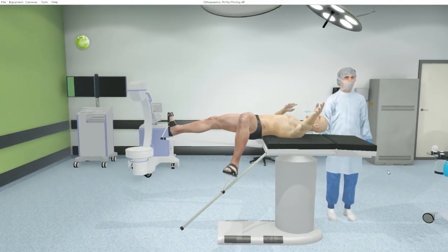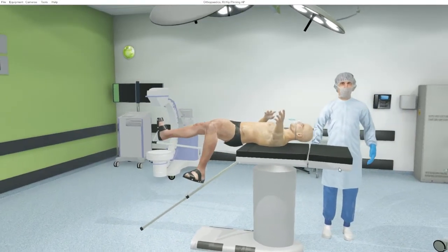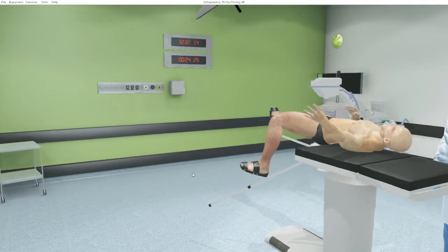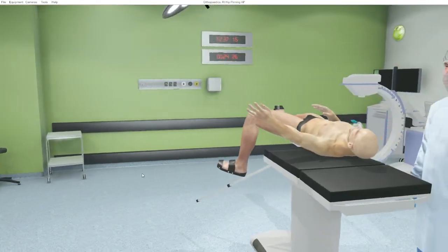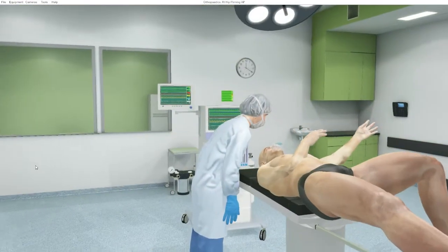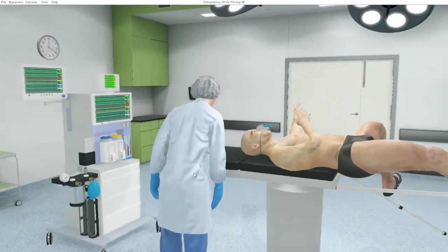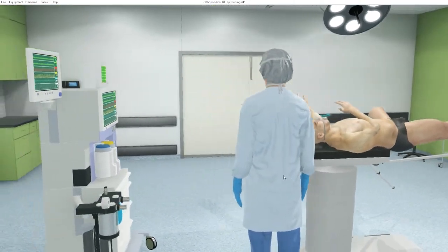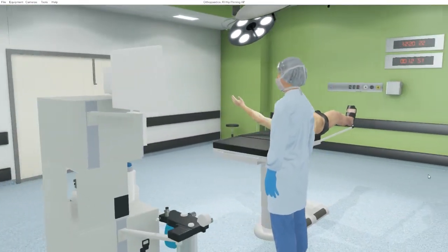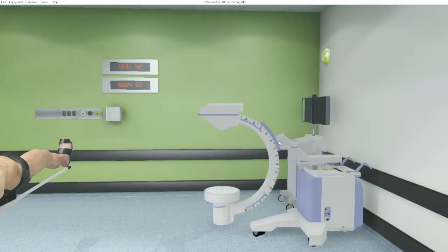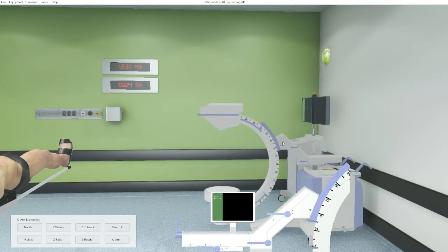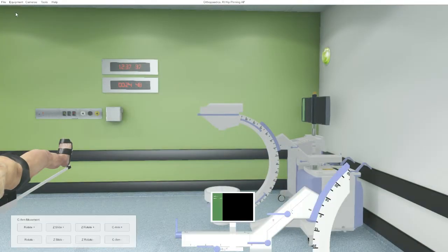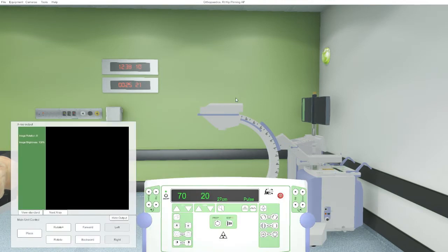Users are tasked with placing the C-arm and the monitors in the most appropriate positions and setting up for the required image. As with other MedSpace VR modules, the equipment controls are accessed by clicking on the relevant equipment control, the drop-down menus, or using the hotkey.